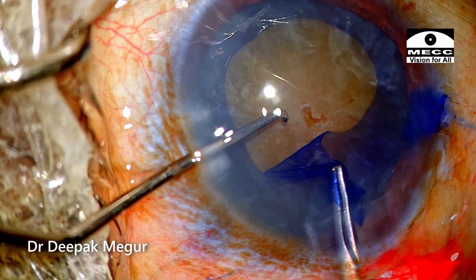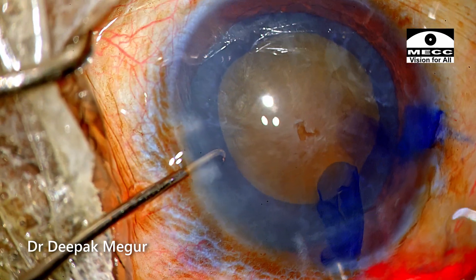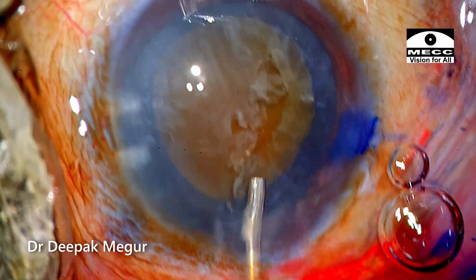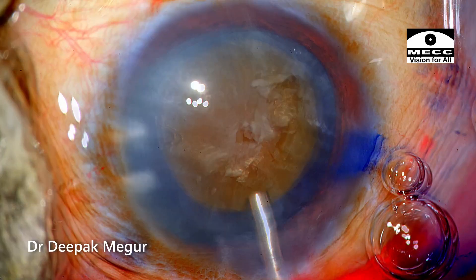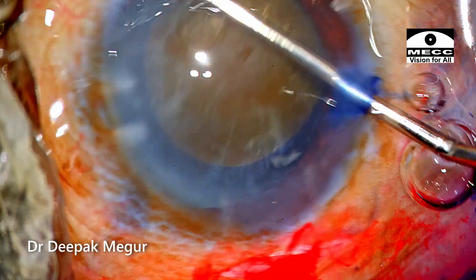There's no evidence while doing the rhexis that the zonules were compromised — they looked in good health. Gentle hydrodissection using very little fluid is done in multiple quadrants to ensure that the corticocapsular attachments are released. Nucleus rotation confirms the same.